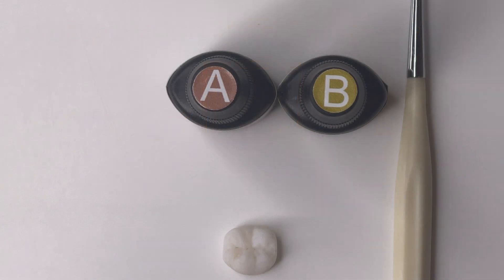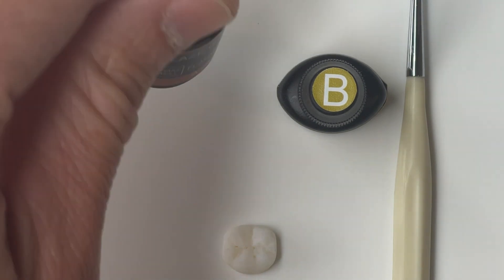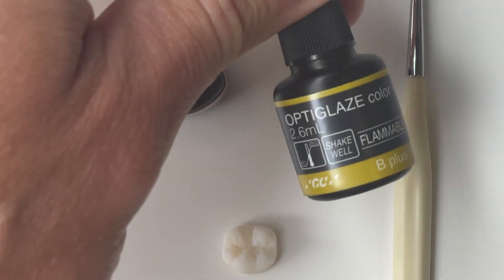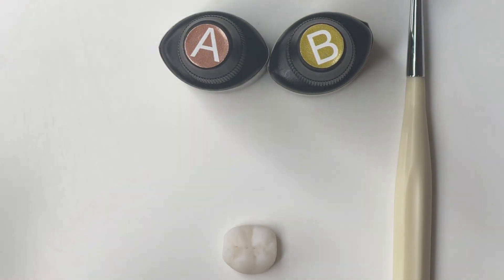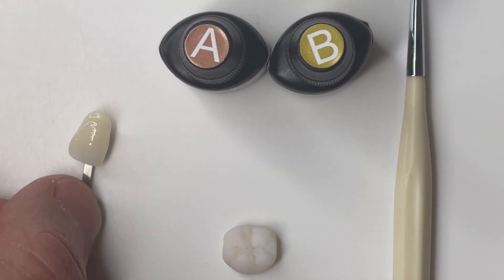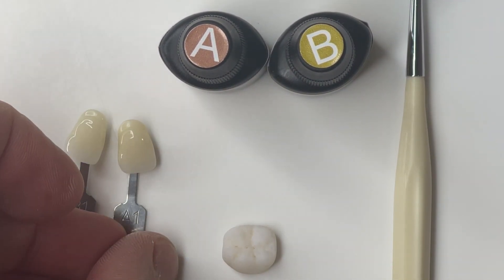Hey everyone, Tony Manito here. I'm going to talk today about staining bleach shade Flexera or any printable resin to an A1 and A2, or even all the way to an A4 — the same principles apply. I have some Opti Glaze Color here, A Plus and B Plus, made specifically for this purpose if you want to add chroma in the A shade range or B shade range. I also have my V2 shade tabs to use as references.